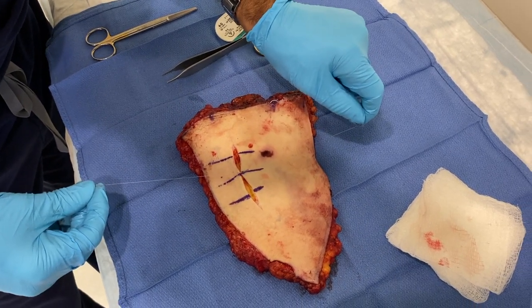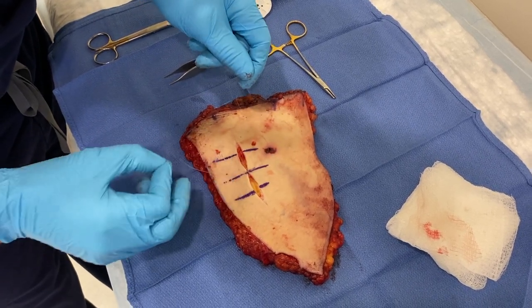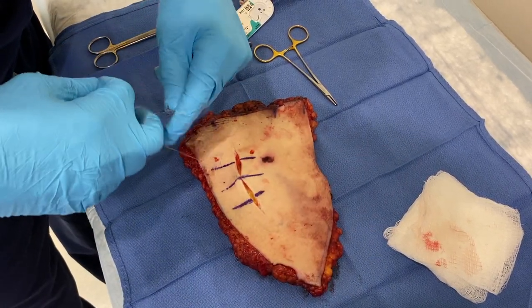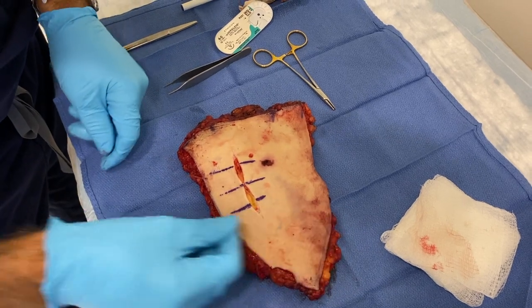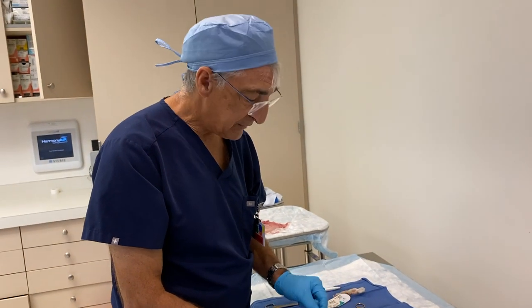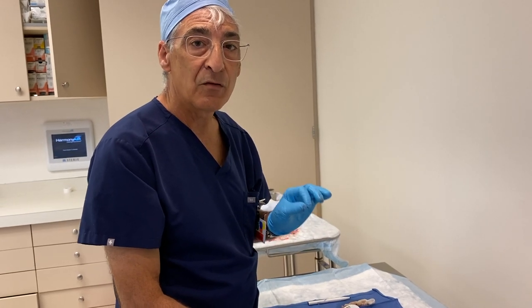As I pull those together gently, my skin margins come together without excess tension, with the square knot going straight across. So there are two throws and I'm going to put down one throw square, adjust tension a little, then another throw square, and another throw. With a simple stitch I'm going to have four knots. If it's a monofilament, I may want five or even six throws, because a monofilament will tend to unravel.